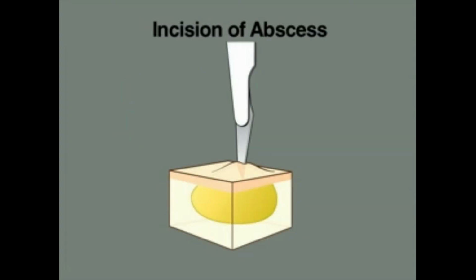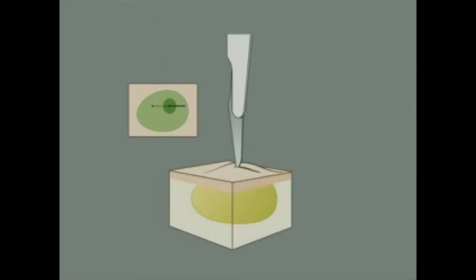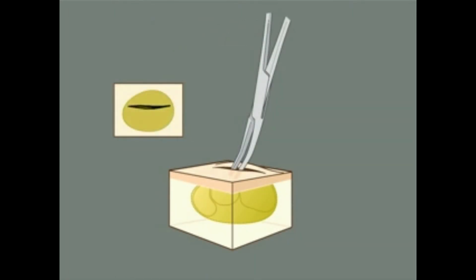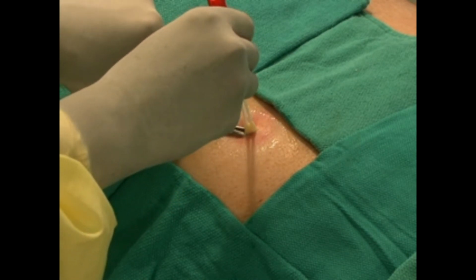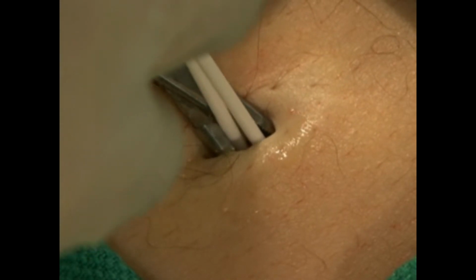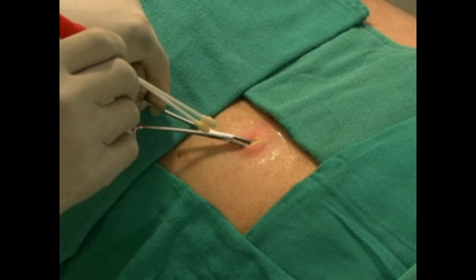Care must be taken to control the scalpel during the stab incision to prevent puncturing through the back wall of the abscess. The goal is to allow enough access for introduction of a hemostat to break up loculations and place internal packing. Use a swab to obtain a sample from the interior of the cavity for bacterial culture. While most patients will not require antibiotics after an abscess drainage, culture information is useful if the patient's condition later worsens and antibiotic treatment becomes necessary.